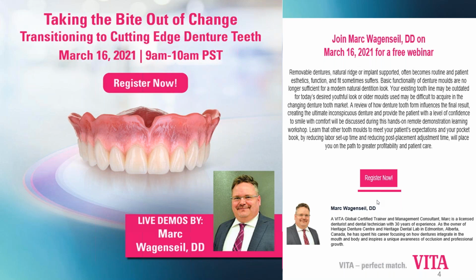And as a technician or denturist, does the Freedom type setup tooth design make a quicker way to set it up? Does it help on the technician side as well as the patient? Yes, it's fast because you're dealing with a mortar and pestle. The upper cusp goes into the lower fossa, and then all I'm adjusting is the guiding plane for that specific chew cycle. And it's quick because it has an easy find centric, where it drops right in because you have the upper cusp come into its antagonist lower fossa. So it's a quick setup.